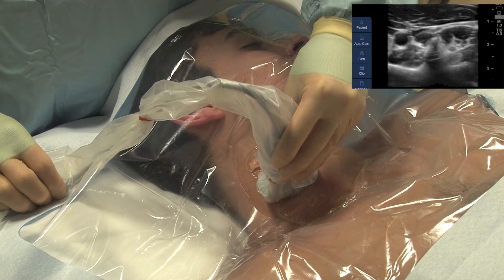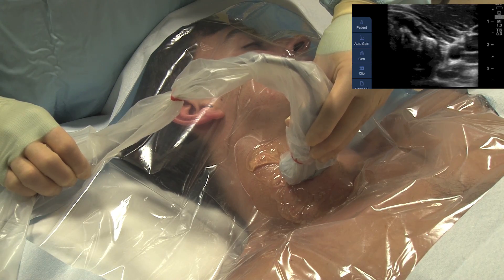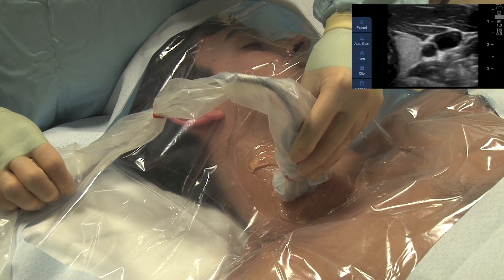Identify the vein by compressing the tissue and note that the vein is compressible while the artery is not. Center the probe directly over the artery and the vein.